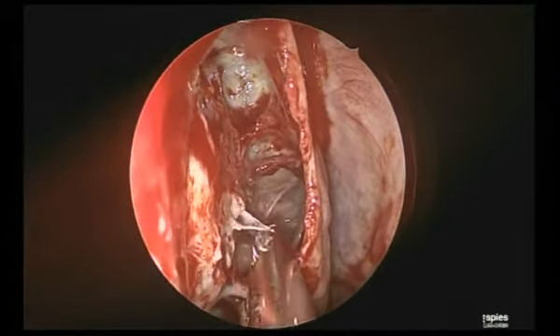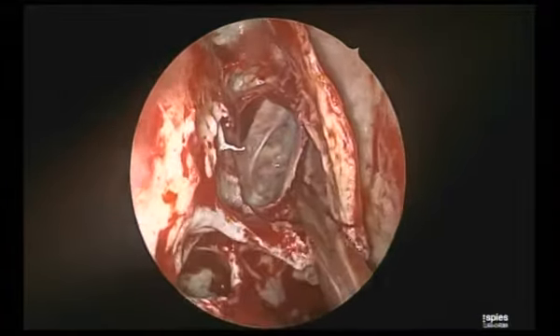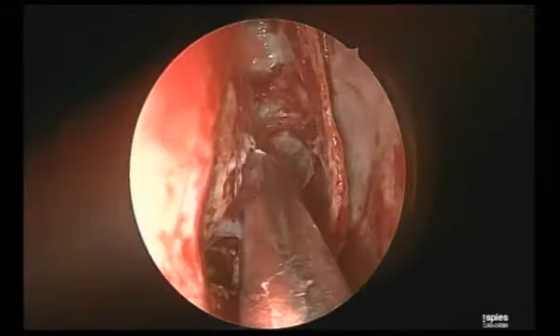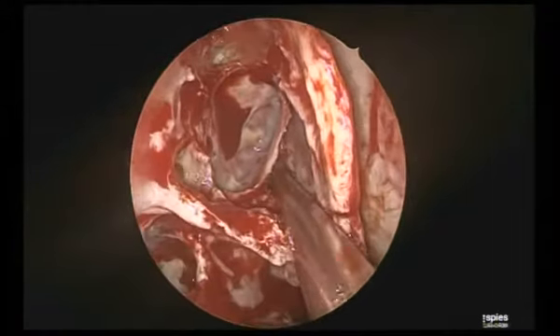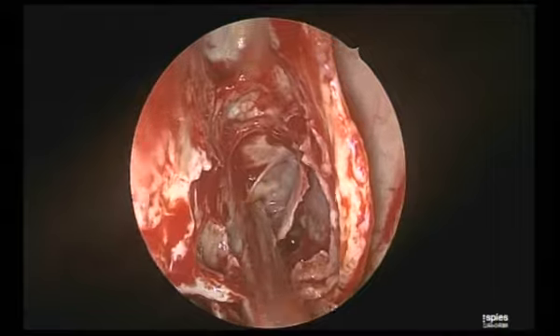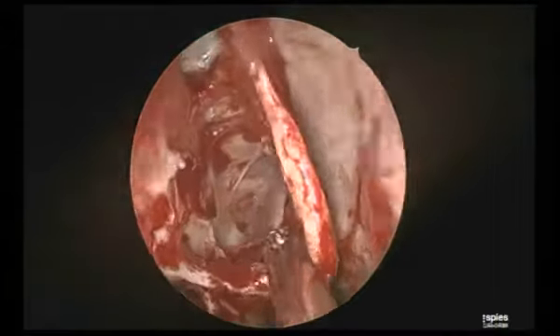Now, dangerous. This is the posterior Onodi cell. Are we seeing the optic nerve there? Does it make a difference? I never bothered. This is Onodi.